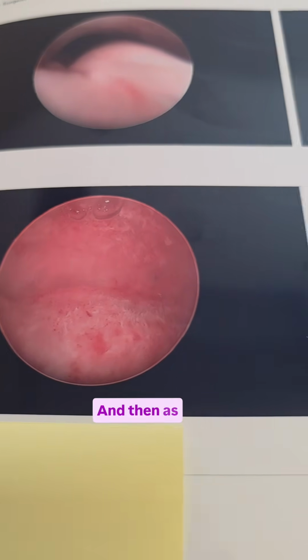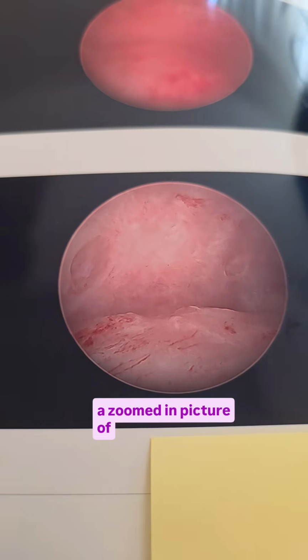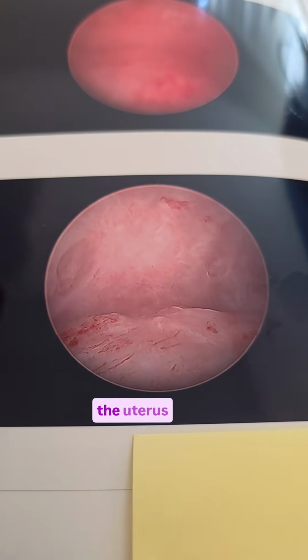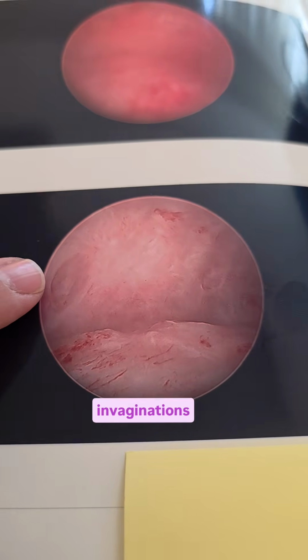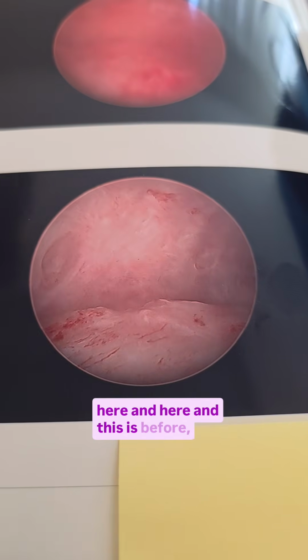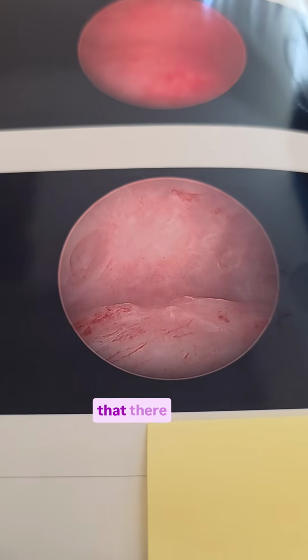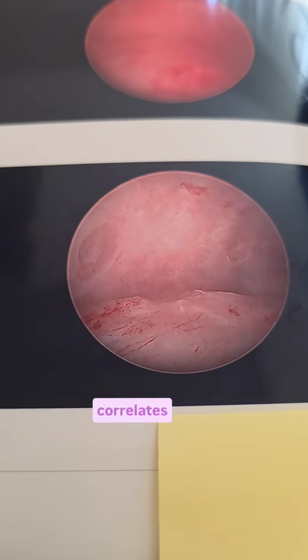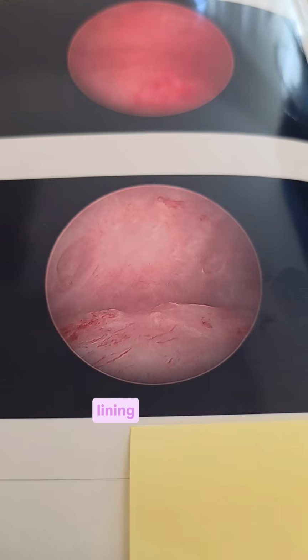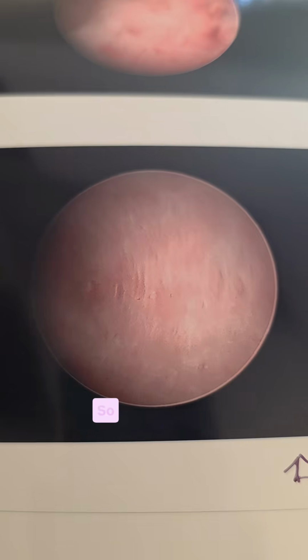Okay. And then as we look closer, this is a zoomed in picture of the top of the uterus, or the fundus. So again, this is the back wall of the uterus. And we see these invaginations that we see here and here. And this was before anything had been done to the uterus. And so we see that there are these invaginations, and that correlates with adenomyosis, because literally adenomyosis is the lining of the uterus starting to push into the muscle layer of the uterus.